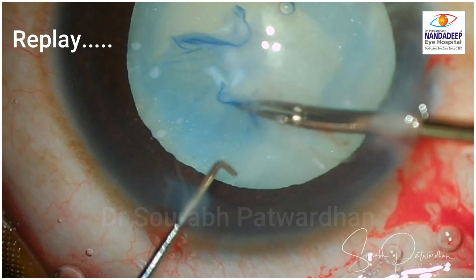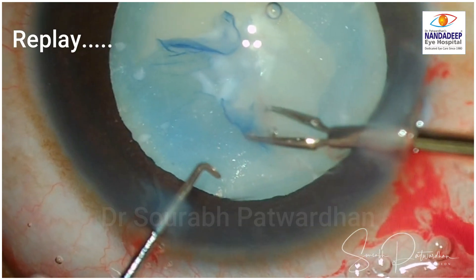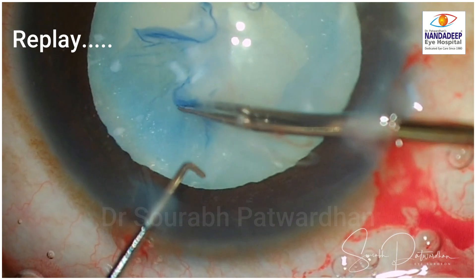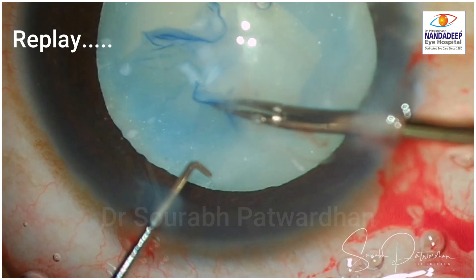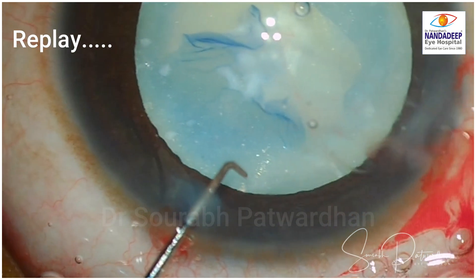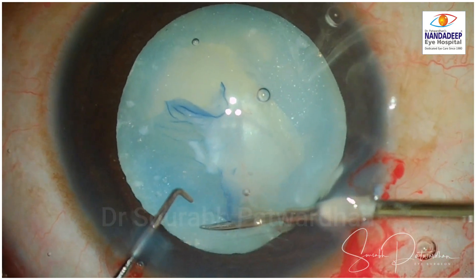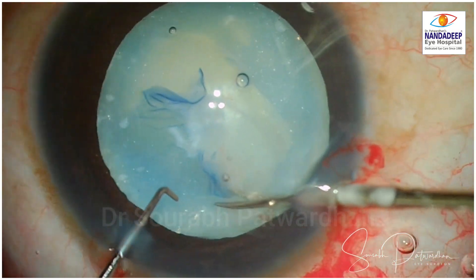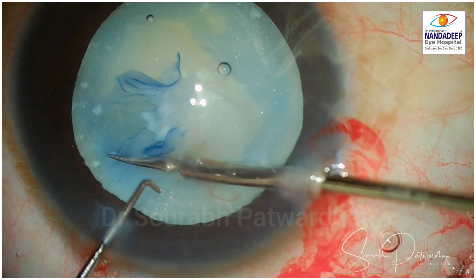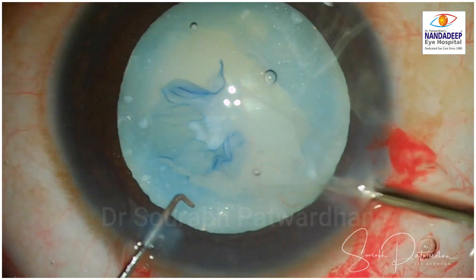You can see it in the replay. You have to judge how much you can pull. If you feel that zonules are good enough and the tear is progressing, you can try to increase the force a little bit to see whether the tear is progressing or not. Otherwise we have to use another instrument — micro scissors. This is the best instrument to tackle this situation. You can go from any angle, change the sideport incision and tackle any area of fibrosis very easily.